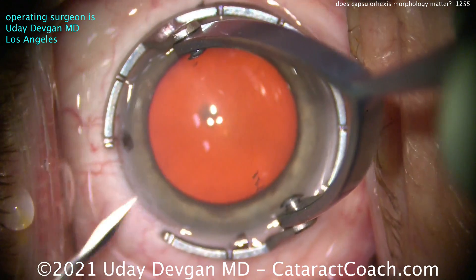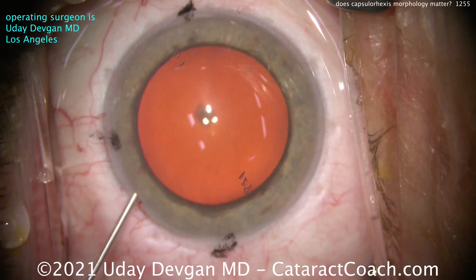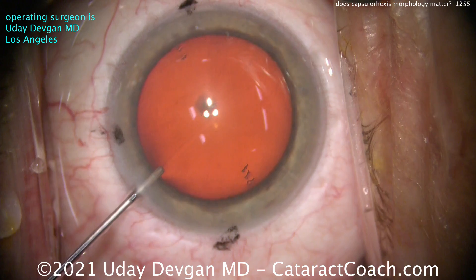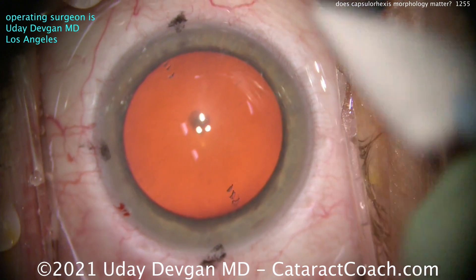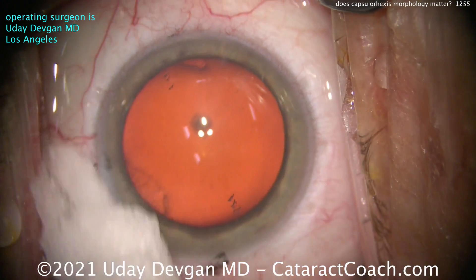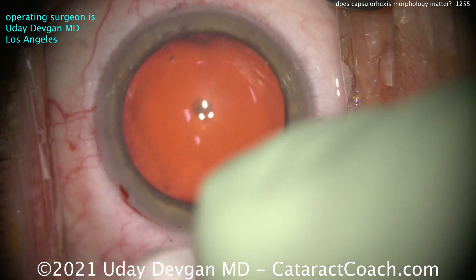I'm going to show you a complete cataract case here. This patient is going to get a toric monofocal lens — the Johnson & Johnson Tecnus Eyehance lens. This is the first incision. You can see the cornea already has the markings. That's the steep axis of the cornea where we want to line up our toric lens. Now we'll brush off some of these ink marks, clean that up, and then we'll start the case.